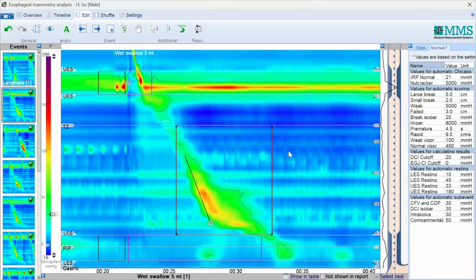So if I understand, a normal study here means we're looking at the upper and lower esophageal sphincter. We can say that they're like gates, and they open and close at certain pressures, according to certain physiology, and they should open and close at the right time. So when you're doing this, before we look at the whole peristaltic wave, what do you look for specifically to confirm the relaxation in the lower and the upper esophageal sphincter?